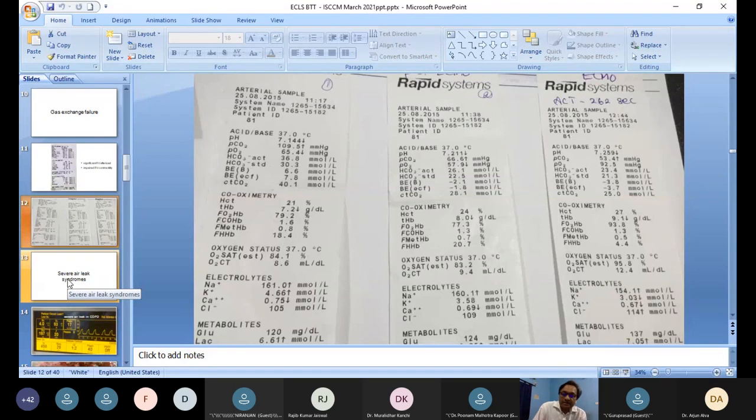So this is a patient on the lung transplant list who's had type 2 respiratory failure, but we were able to, because of body size, the problem with putting the single lumen cannula is that the flows are going to be lower. So if you're going to have a severe problem in terms of hypoxemia, you may not be able to oxygenate enough of the cardiac output. So it may be inadequate. However, if you are able to get your requisite endpoints in terms of gas exchange, whether it's carbon dioxide clearance or oxygen, then a single lumen cannula should be more than enough.